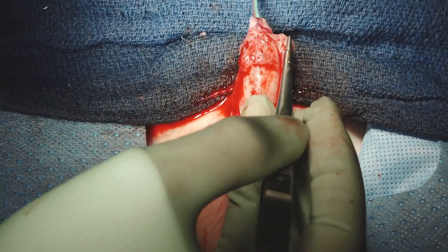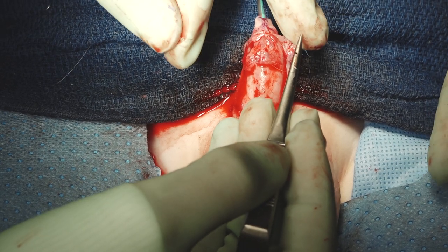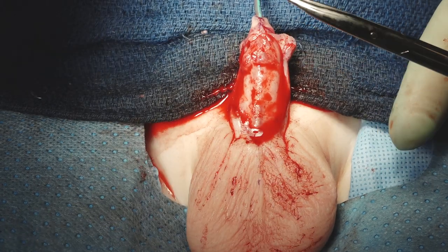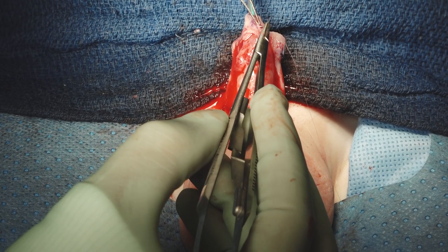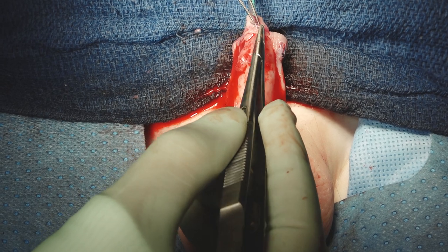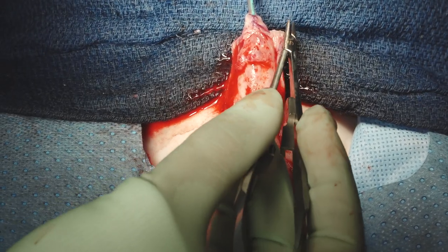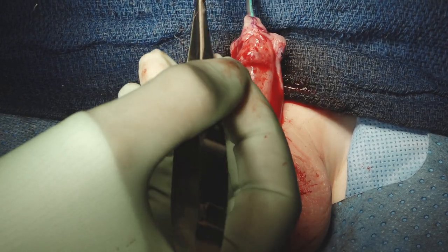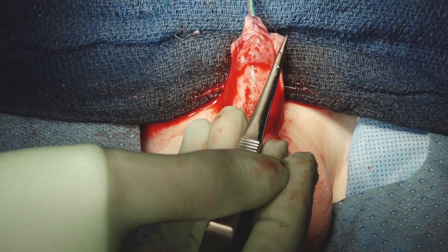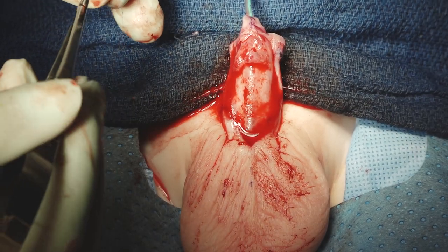This is one reason we wanted to film this today. This is not a severe torsion — certainly they can be twisted all the way around to 3 o'clock. But even starting out between 5 and 5:30, it changes these little nuances and you have to be cognizant of them and adjust. You can do a sub-epithelial suture here, but it's much harder. That's why we like this little 9-0 — we can put it through the epithelium without fear of leaving a major suture tract that has to be dealt with later. The median raphae is now lined up right at the exact normal midline spot — so we might just leave that.